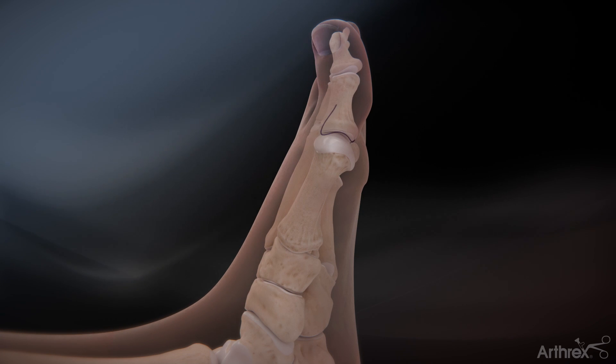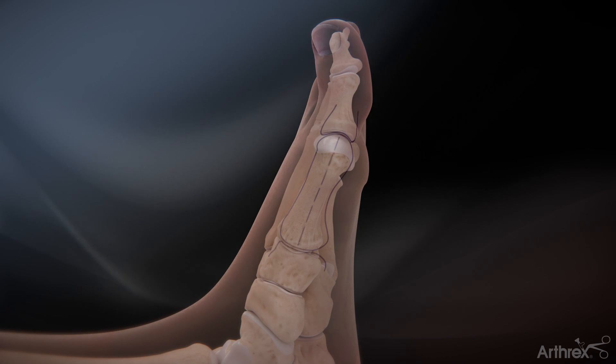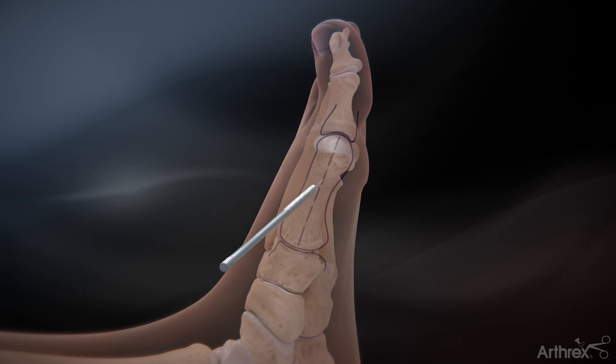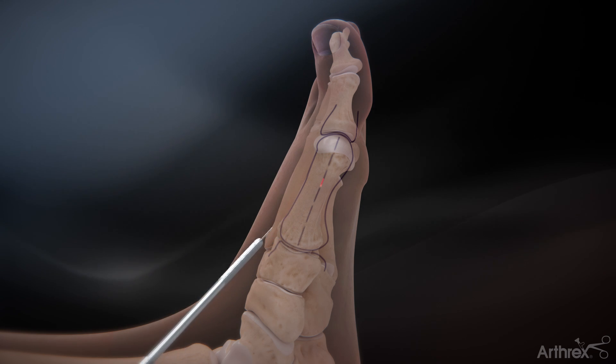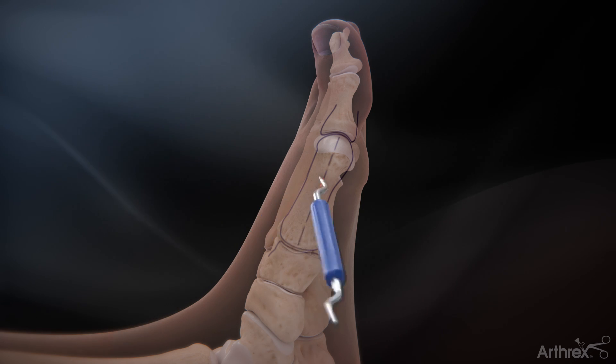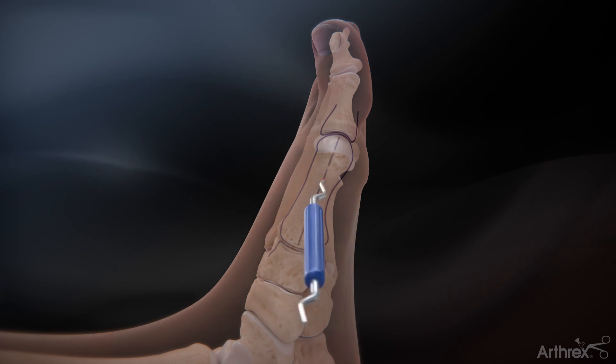To begin the procedure, mark the bony anatomy and midline of the metatarsal. Make a stab incision on the midline of the metatarsal, just proximal to the sesamoid complex. Use the periosteal elevator to free the soft tissues at the osteotomy site.